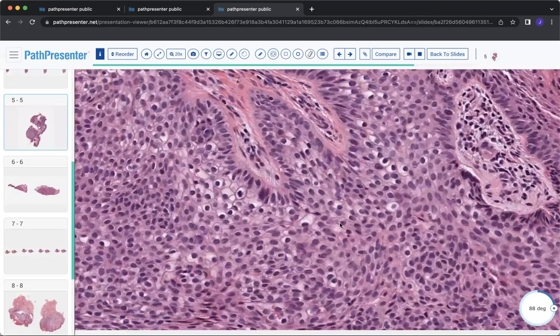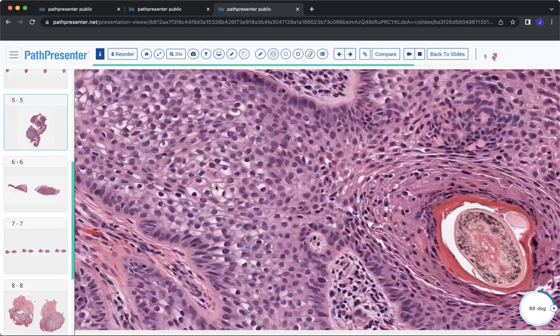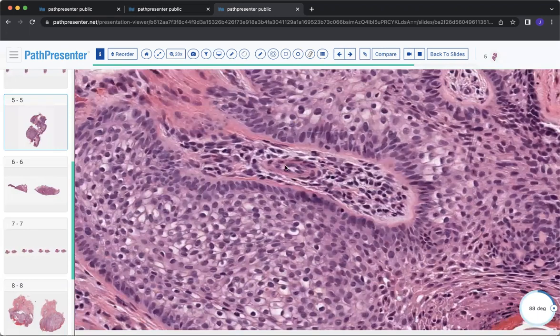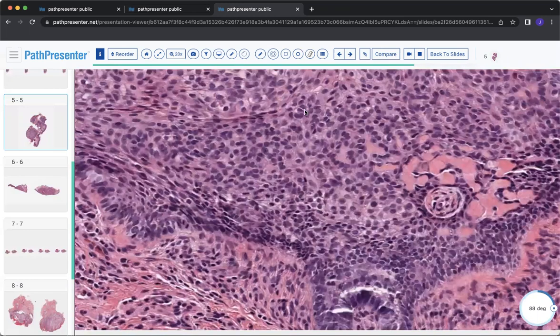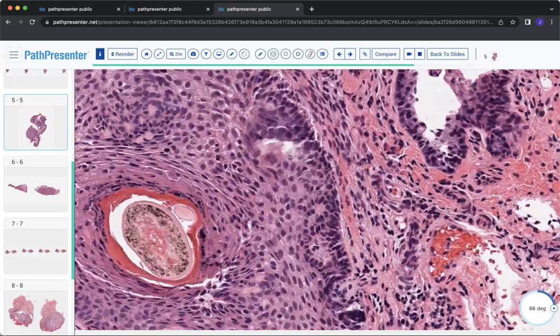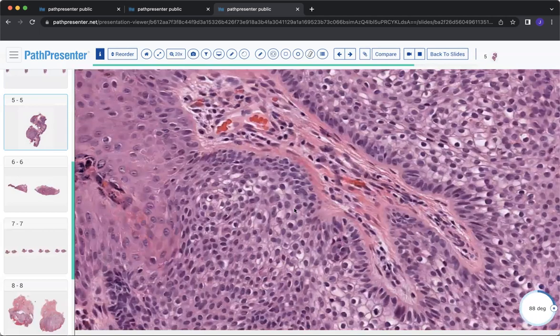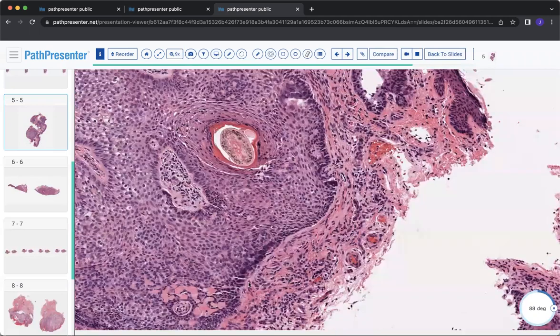And it's reminiscent of the outer root sheath of a terminal hair follicle. So you've got a clear cell population. You also have this peripheral palisading of cells that has this outer thick eosinophilic basement membrane-like material tracing around the peripheral island here. And so when you have that combination of the clear cell differentiation along with the peripheral palisading and the eosinophilic rim, in many of the areas, not in all areas, but in many of the areas, then it should bring up the possibility of a tricholemmoma.